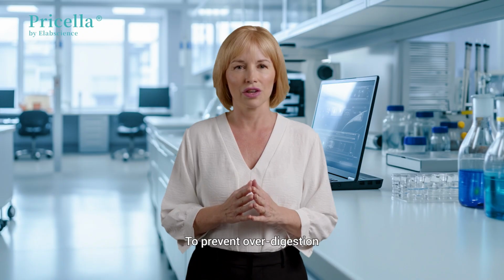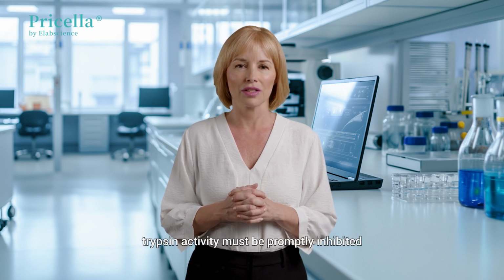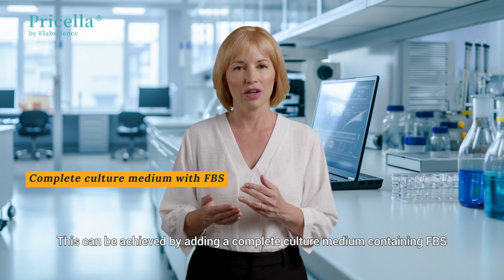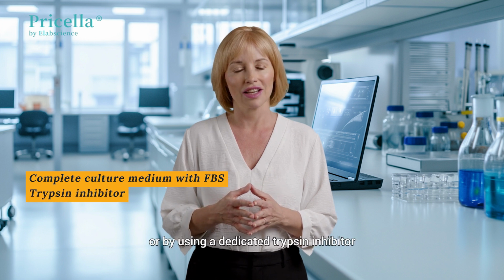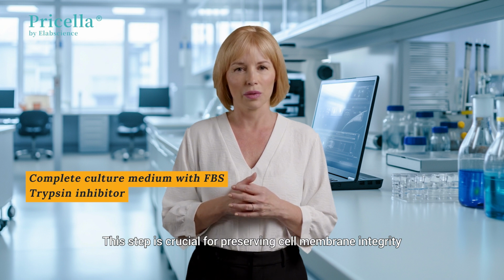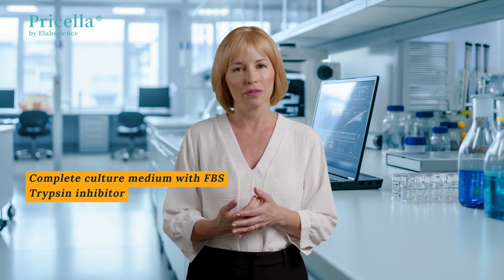microscope. To prevent overdigestion, trypsin activity must be promptly inhibited. This can be achieved by adding a complete culture medium containing FBS, which provides protease inhibitors, or by using a dedicated trypsin inhibitor. This step is crucial for preserving cell membrane integrity and ensuring optimal post-passaging recovery.